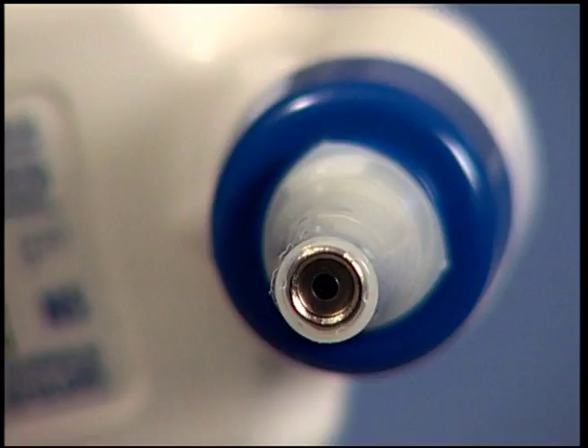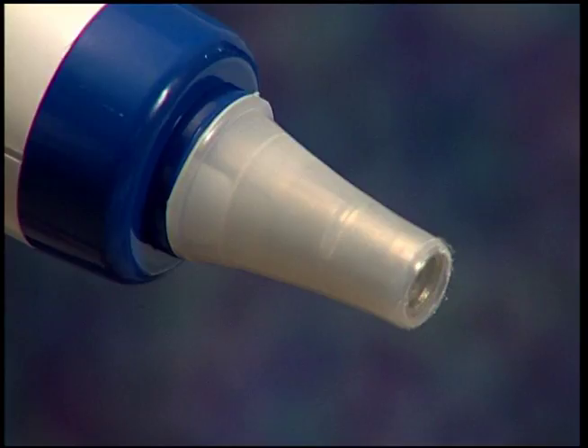If there are any visual holes, tears, or wrinkles, discard and attach a new probe. You will know the probe cover is attached securely if the silver probe tip is completely covered. An improperly attached probe cover will not take accurate readings.